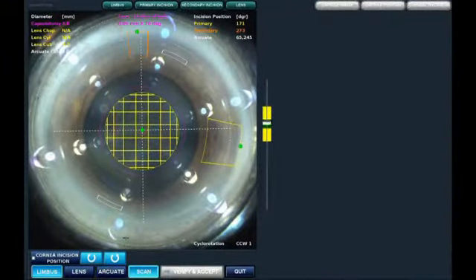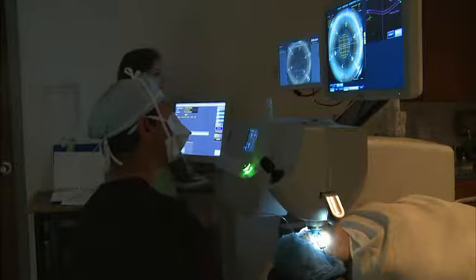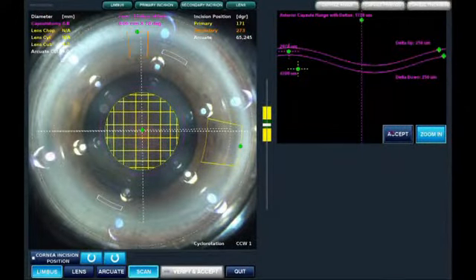This is using the new matrix cube pattern to divide the lens. In the new software it automatically finds the limbal landmarks as well as presets all of the incisions based on the surgical plan. So we can pretty much go right to high definition OCT scanning.